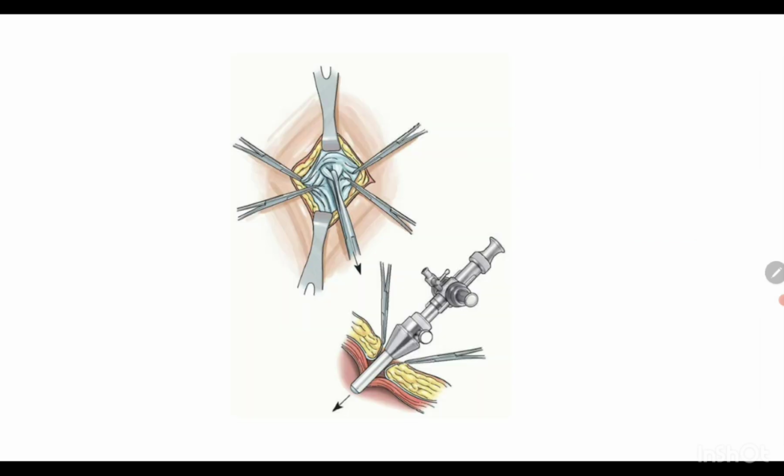You can see the incision is given. After the skin incision, it is taken down till the fascial plane. This fascia has been tented, and a retractor is given. With the Allis forceps, you can give the incision with scissors. Then the edges have to be sutured. Then you enter the Hassan cannula.